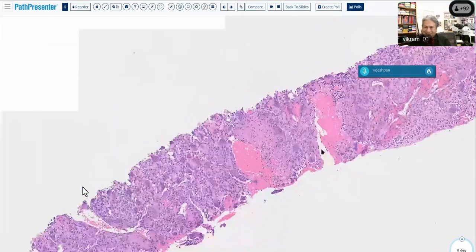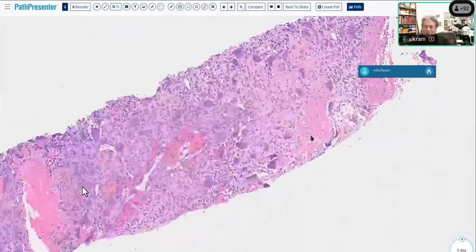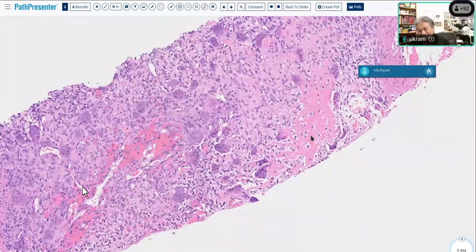All right, so you can see a fair amount of bone in an ABC. So it's another neoplasm that you don't generally consider a bone forming tumor, but you can see a fair amount of bone. Shushma has some comment. I see. I have very little experience with those markers, except that I would say I'm not a great believer in USP6.